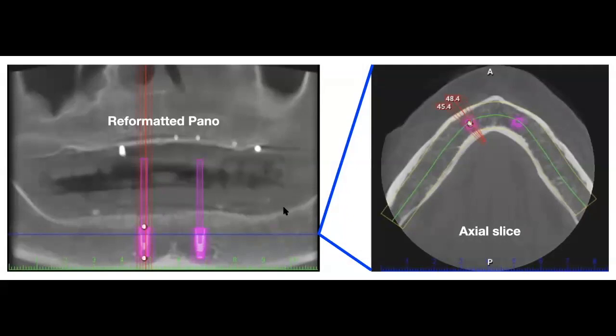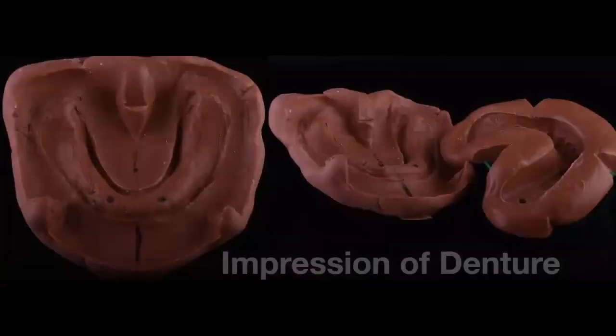We're looking at the site. We're looking at, where do we want them to be located? Just kind of give us an idea. We're looking at the bone width and height on site of implant number 22. And we have the same thing for the implant site on implant number 27. So we know, and you can see on the CBCT, that we have enough bone height and width for these implants. So this is a very straightforward case in regards to implant location, because there was a lot of bone in the patient's mandibular arch.